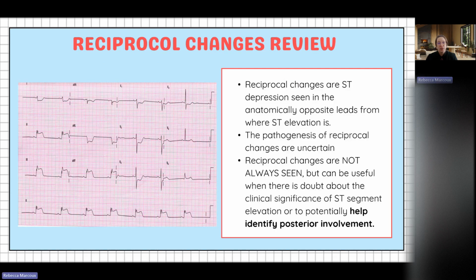And in the case I just talked about, if you don't see changes on ECG and you also have a TNI that came back positive, that's another indicator that we're missing something. We need to take a closer look. So it's not a bad time to do your posterior leads. Right-sided leads don't occur in isolation pretty much at all, but our posterior does.